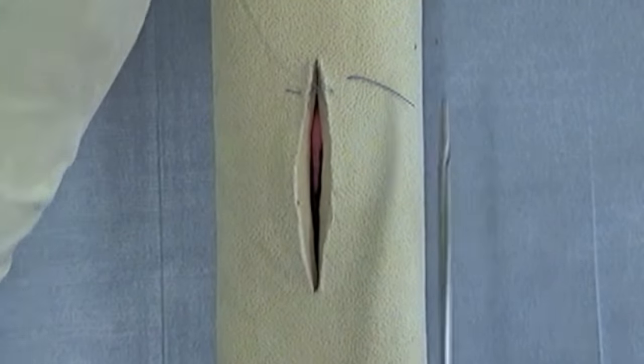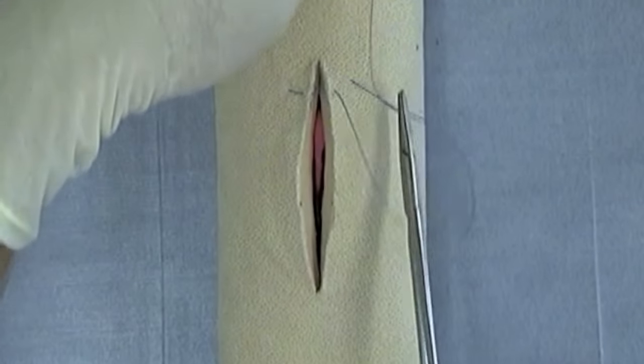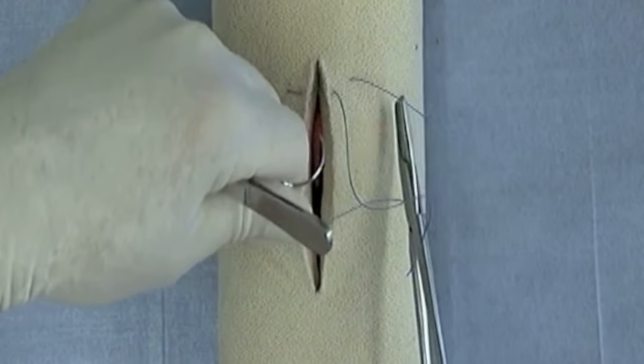You can see that when I tie this, the skin edges will be everted.